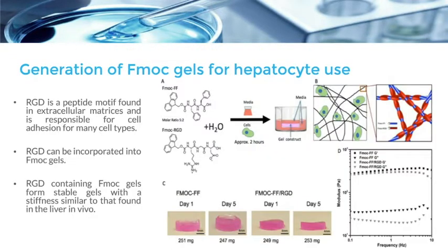Basically, as I've mentioned already, it's really important to try to include components of the hepatic or liver microenvironment that would mimic what we see in vivo, but now in vitro in a hydrogel. Many groups have tried a variety of different natural, non-synthetic approaches.